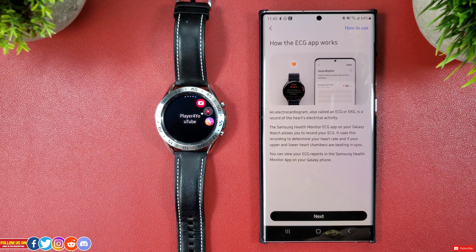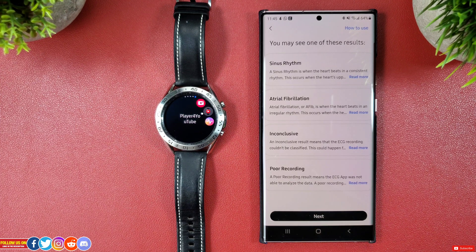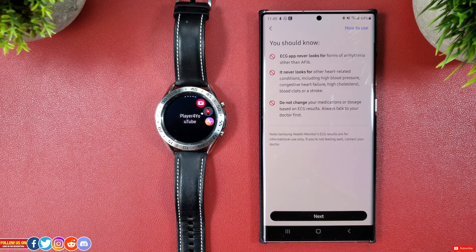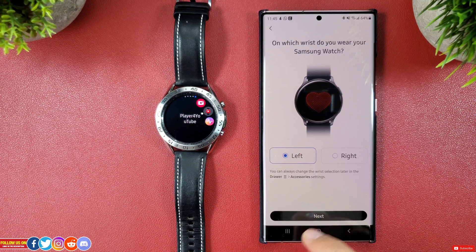When you click on Get Started under ECG, you will get a brief info about how ECG works. Go ahead and click next. You will then get a brief explanation of what each result means — go ahead and click next after reading. There are a few disclaimers, which not just Samsung but every smartwatch manufacturer will make you read. After that, select which wrist you place the watch on, and that is it — you're all set.